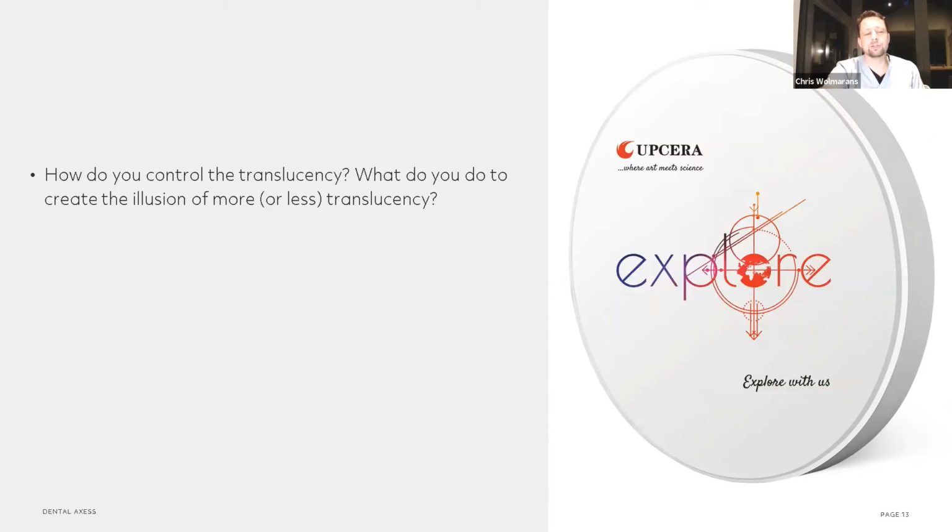The one thing I also want to say is with the functional, the one thing that I really like about this ceramic is when you go into the 1200 plus MPa zone for zirconias, a lot of the time when you do bridges, you get in the pontic area a high value, low translucency, and it's quite overwhelming and quite in contrast with the crown next to it.